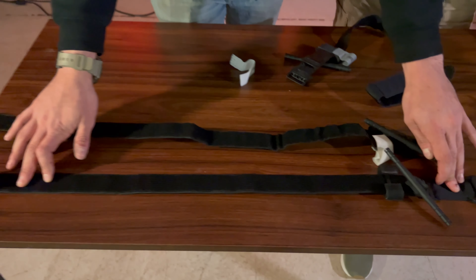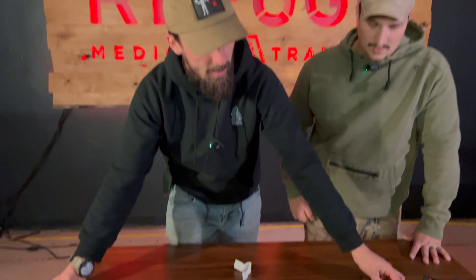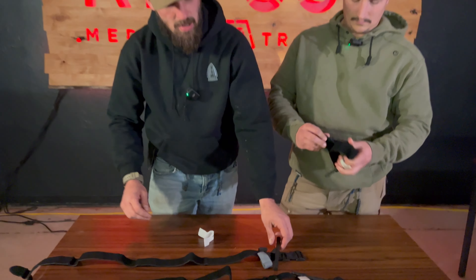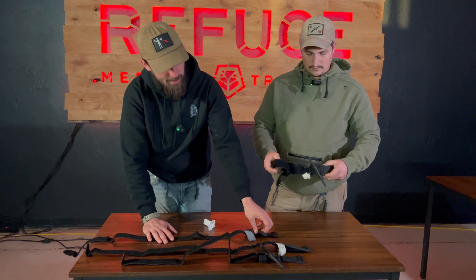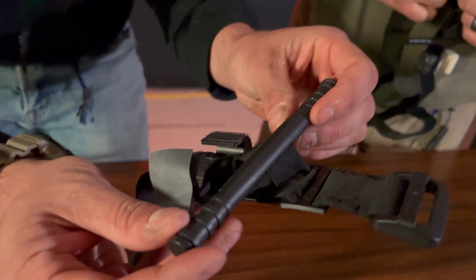These are two fake tourniquets bought from different places on the market at the same price, and they're completely different products. This one is even shorter — it'll be really hard to get around a leg. This one is a little bit longer but still not as long as the CAT Gen 7. The soft T is the longest actual tourniquet; these are not actual tourniquets.